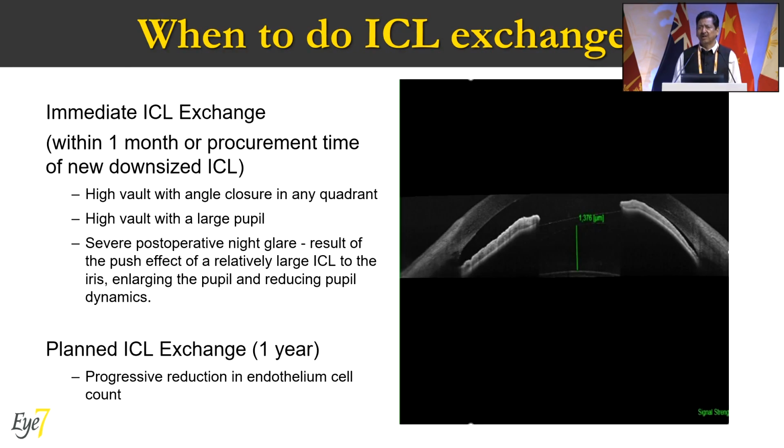When do you really need to do an ICL exchange? You would do an ICL exchange when these problems are happening immediately. One, there's a high vault with angle closure in any one quadrant. On ASOCT, you can see there's an angle closure here. The rest of the quadrants are open. So this merits immediate ICL exchange to a lower size.